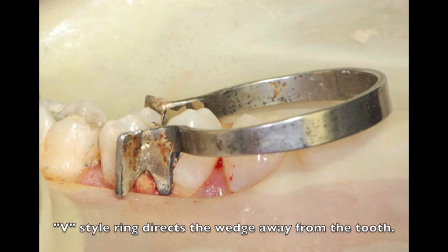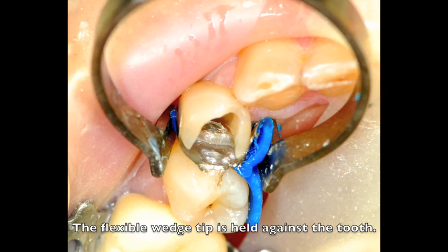Here we have a V-style ring straddling a wedge, preventing the wedge from adapting to the tooth. Compared to an ABC wedge, where the tip comes through on the buccal, and now the tip can be flexed against the tooth and sealed off with the separating ring.